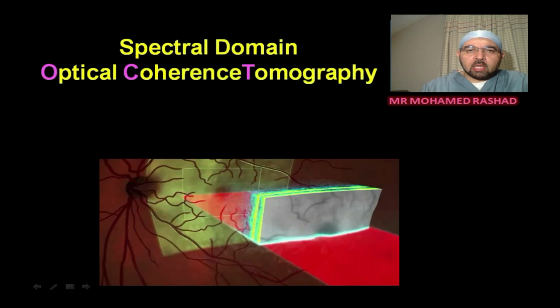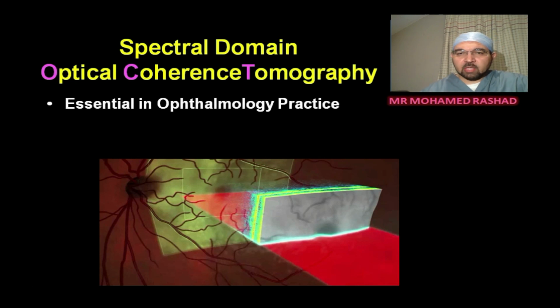in the eye. The spectral domain OCT now becomes a very essential part in ophthalmology practice and especially retinal practice, and sometimes in our clinic, before we see the history of the patient, we see the OCT scan image. I know this is not typical, but this is what happens in our daily life, and there is no retinal clinic without OCT. In the exams, it is a very essential part. In all the postgraduate exams, you're going to be asked about OCT, especially the FRCOphth exam.